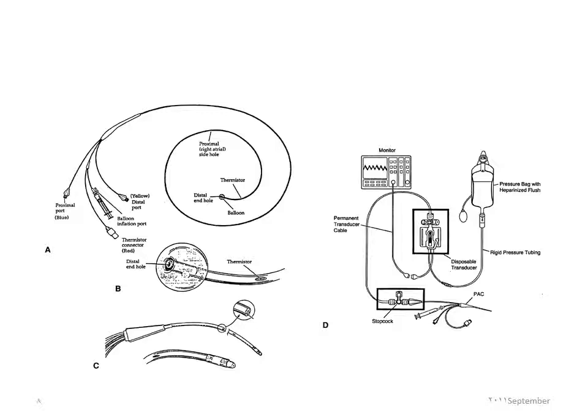This picture clarifies the whole system that is used to measure the pulmonary artery pressure either in the right atrium, right ventricle, pulmonary artery, and at the wedge of the artery which is called pulmonary artery wedge pressure.